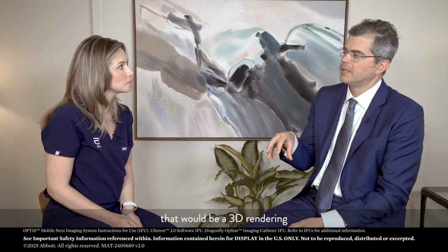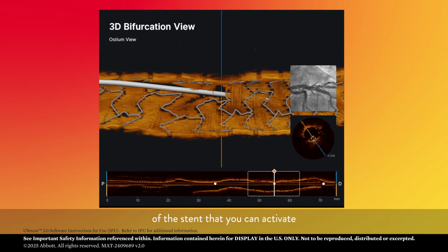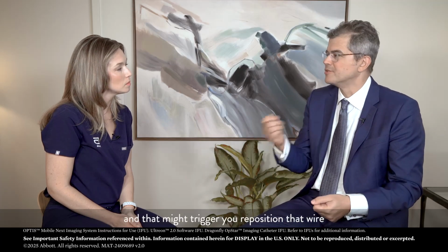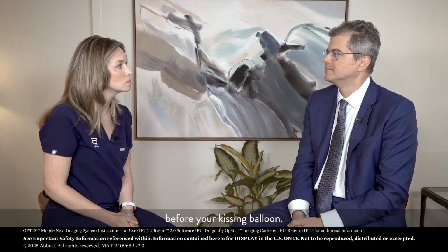So what is available on OCT to help you is 3D rendering of the stent that you can activate, and you can clearly see where your wire is crossing, right, whether it's a more proximal or distal cell. And that might trigger you to reposition that wire before your kissing balloon.